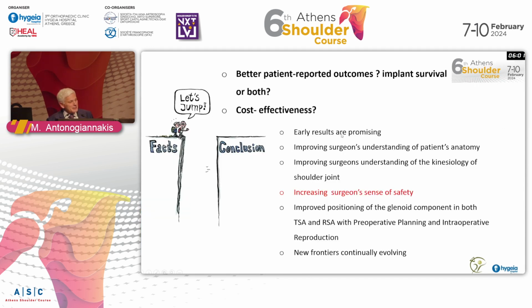In the end, we are going this way and we can't go back. And it's real, and it's correct that by preoperative planning we increase our understanding of what we have to face. I remember the time when I had an X-ray and I said, okay, I'm going to do a total shoulder replacement.